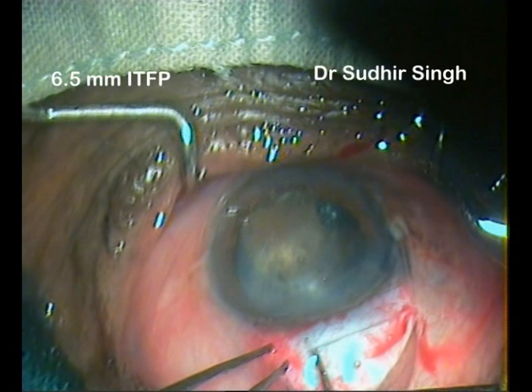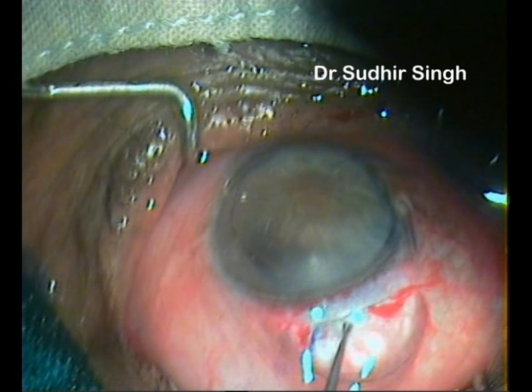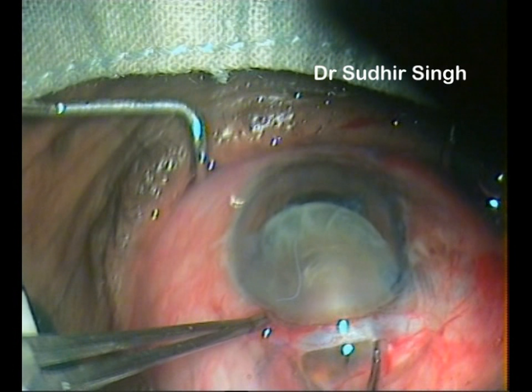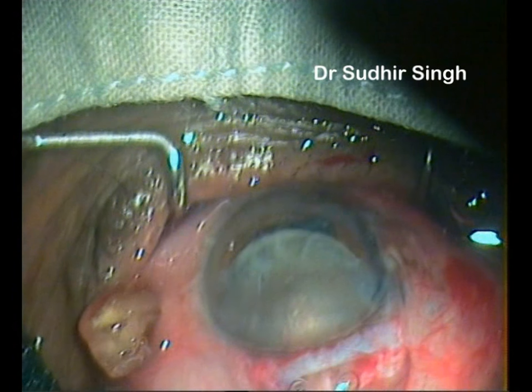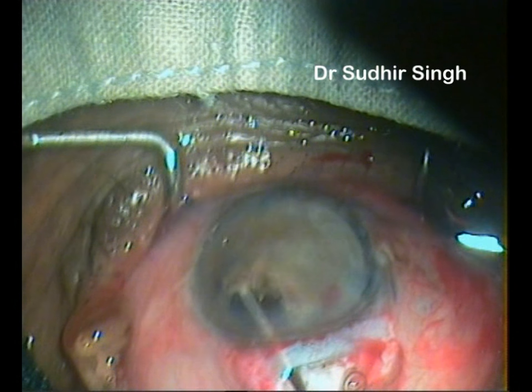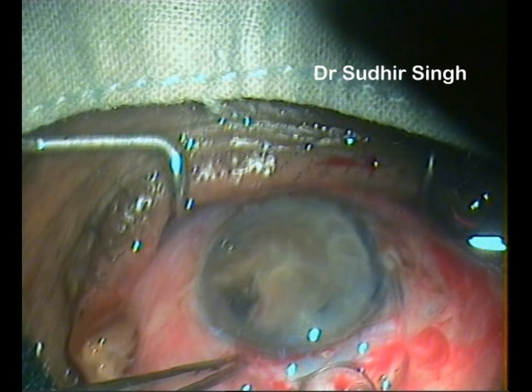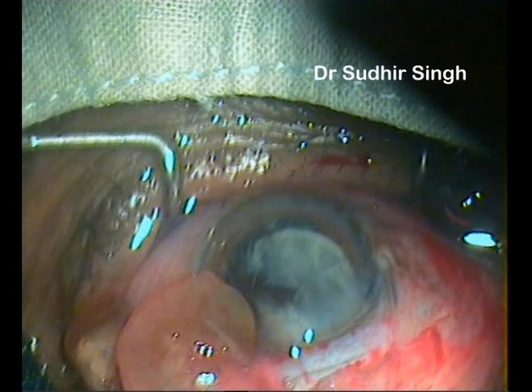The nucleus is prolapsed into the anterior chamber with the Sinsky's hook. The vectus is introduced and positioned behind the nucleus. The nucleus is engaged in the vectus and slowly withdrawn while the posterior lip of the tunnel is depressed. When the nucleus is engaged in the tunnel, the vectus is pulled posteriorly and upwards. This causes breaking and removal of a part of the nucleus, while the other part remains engaged. The engaged part is pushed back and rotated so its longitudinal axis coincides with the longitudinal axis of the tunnel. The remaining part is taken out slowly while the posterior lip of the tunnel is depressed. Remaining cortical matter is cleaned up.